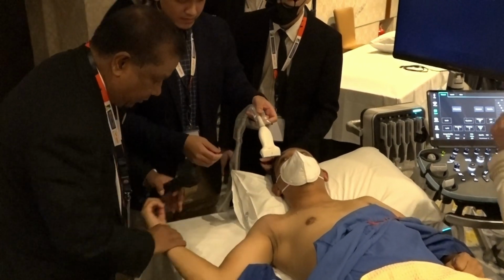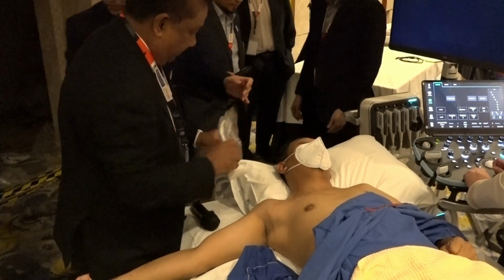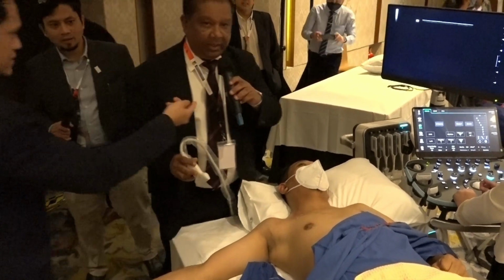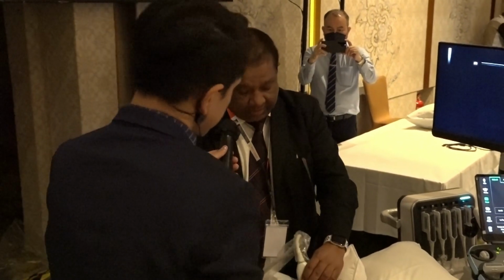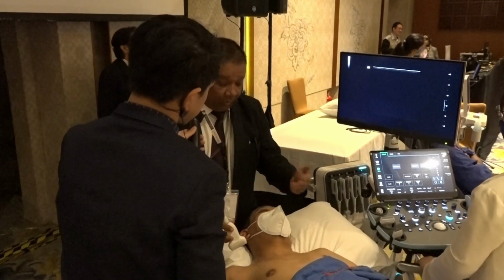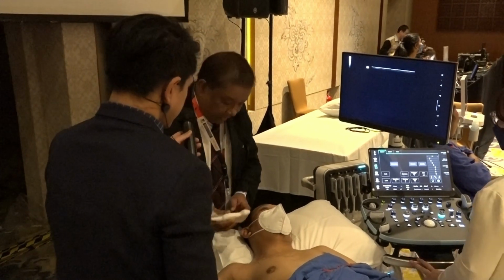Can you just put your arm like that? Also, if you are performing the scan or the block and you're a right-handed individual, I would usually stand on the top, because then it allows you to use your right hand, okay? If you're a right-handed individual doing a left block, then put the machine here and you stand over there. But the position of the arm will be like so.